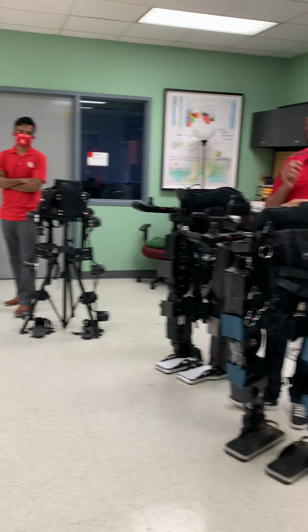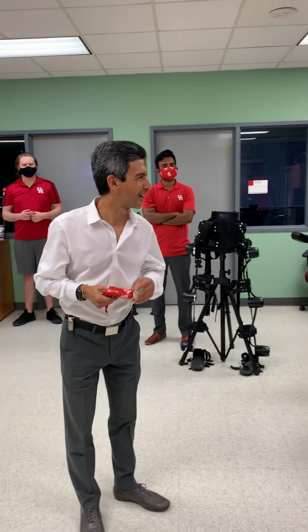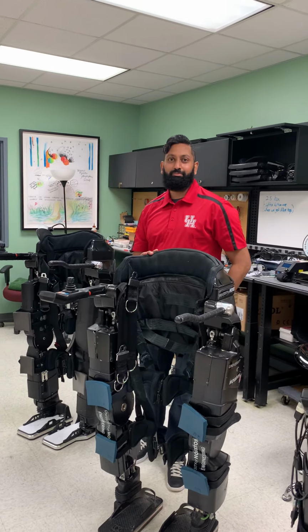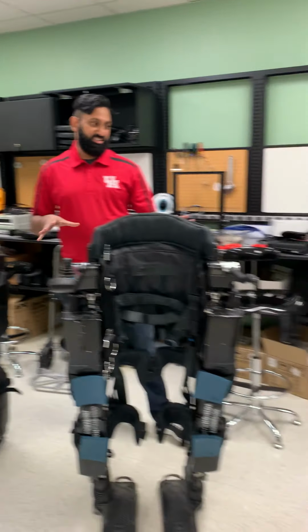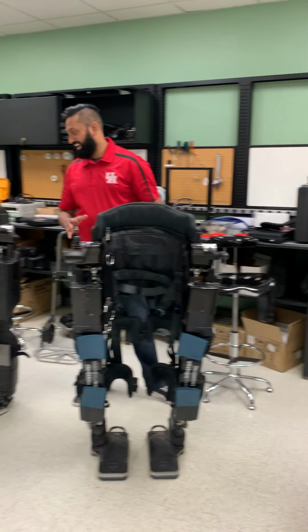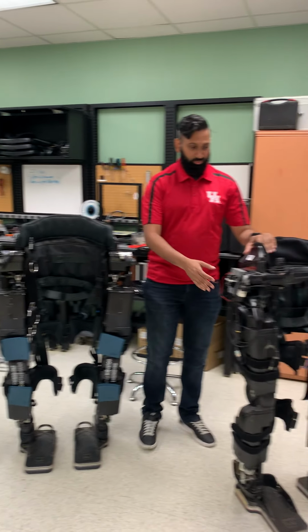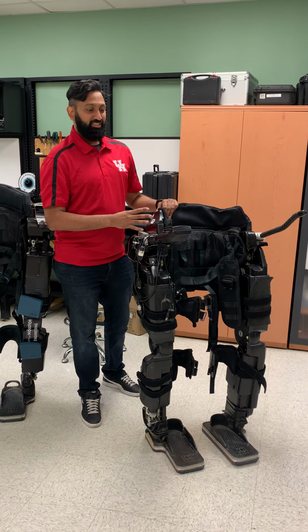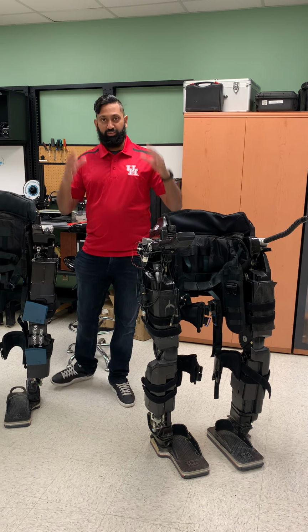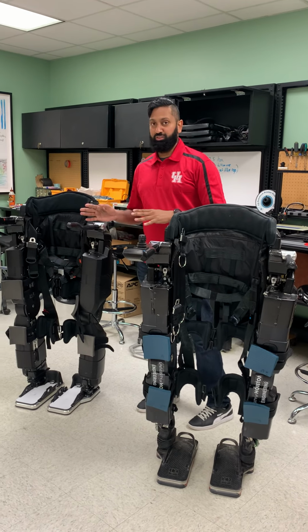I would like to introduce now Kevin Nathan, a recent PhD and soon a postdoctoral fellow in the lab working on neurorobotics. Hi, so my name is Kevin Nathan, and these are the exoskeletons developed by Rex Bionics. There are 3 different generations, so you can kind of see the developments over time. And what we started, especially with this one, is we built a wireless interface that can be controlled by brain-machine interface. So we've been doing studies on how we can use EEG to detect signals to walk and stop and to control the walking motion of the Rex.